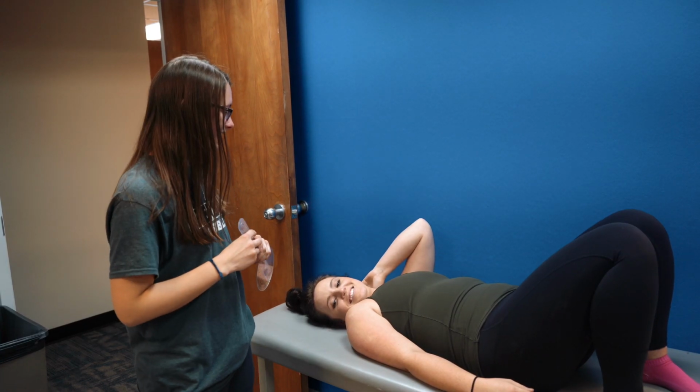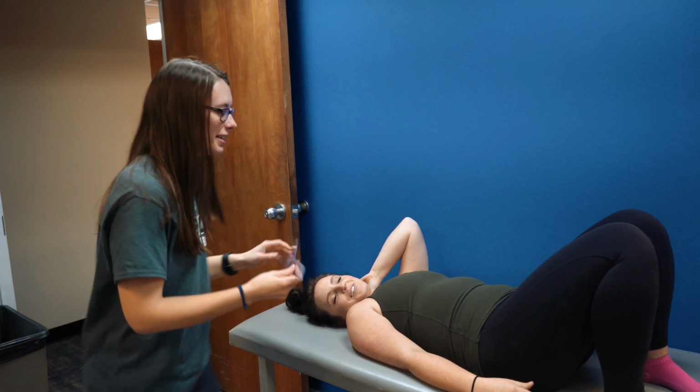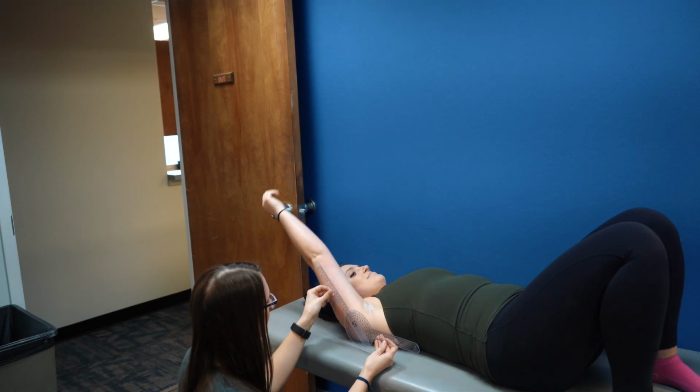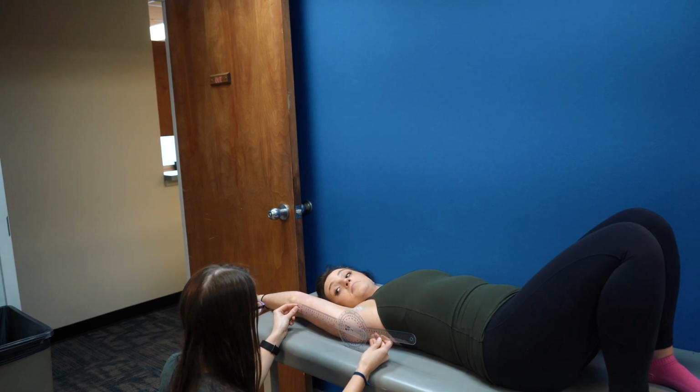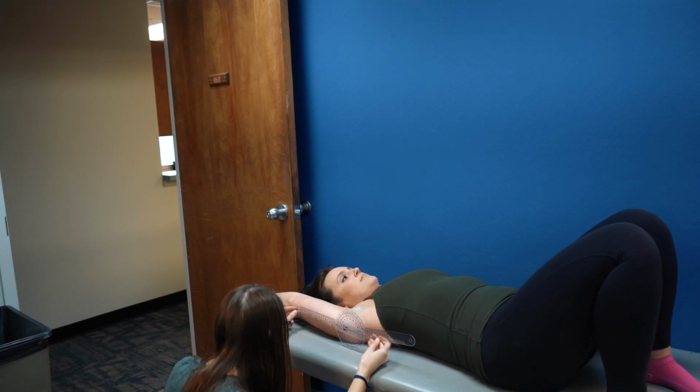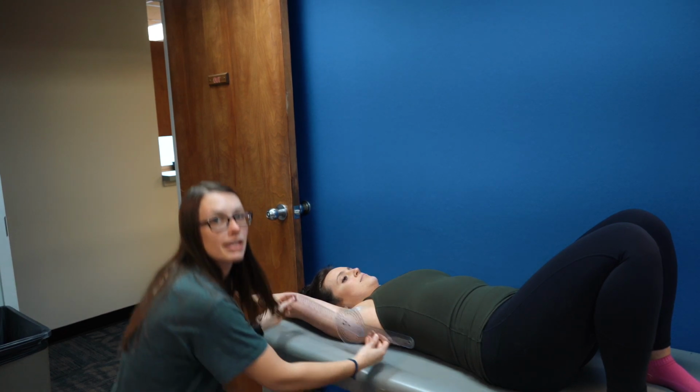We will be testing on Kennedy's shoulder flexion. So we're going to put the fulcrum right here at her shoulder, and go ahead and flex back for me. Okay, and then we're going to line it with the lateral side of her epicondyle. And she is at 170, which is within normal range.